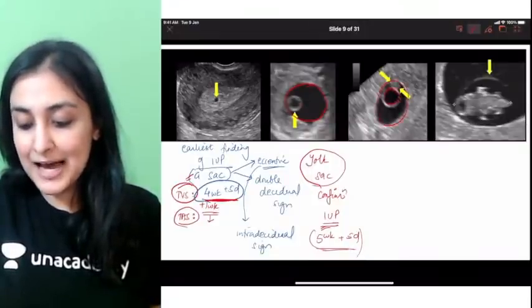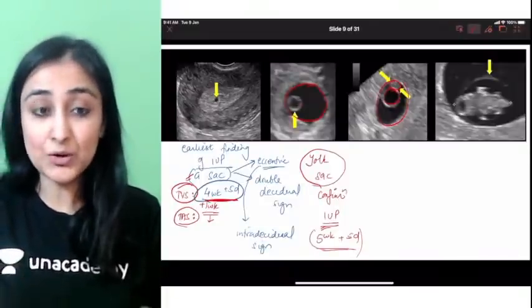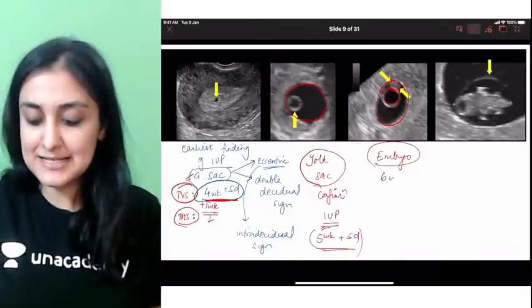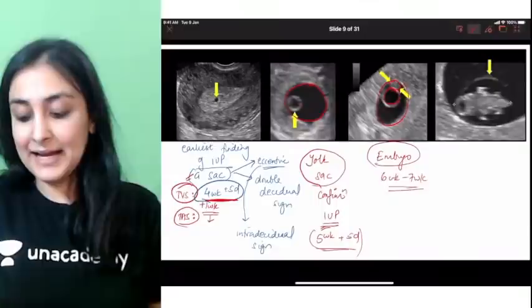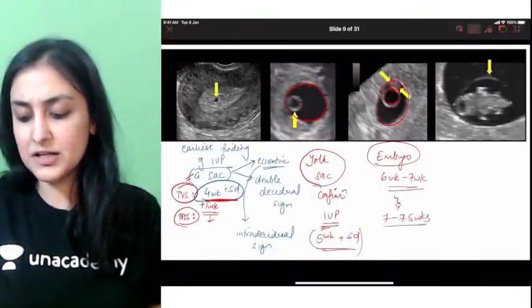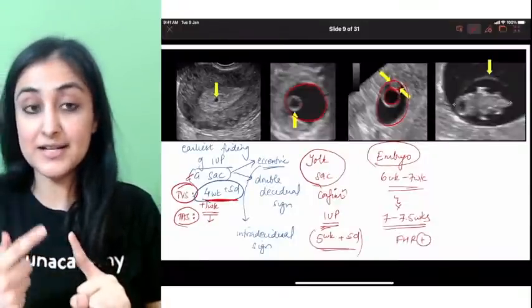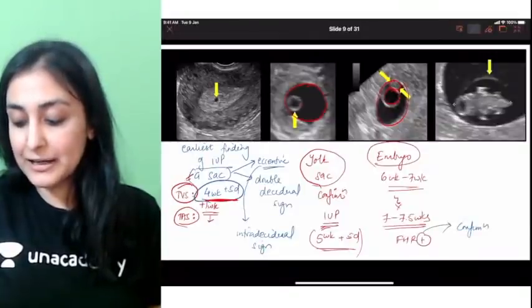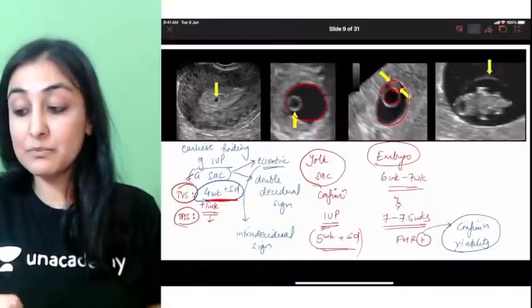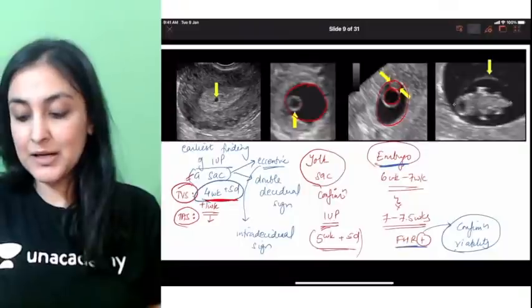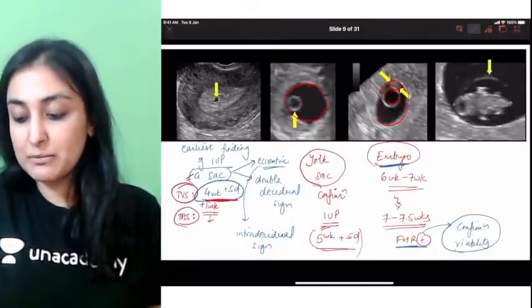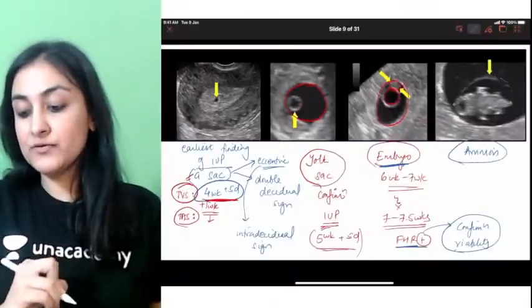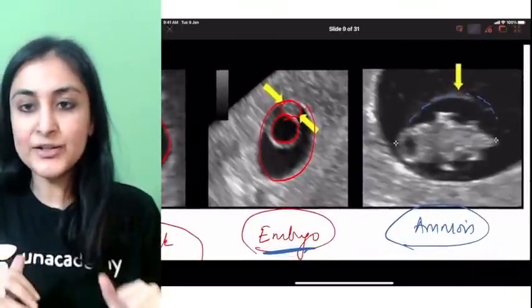At 6 to 7 weeks the embryo shows up. From 7 to 7.5 weeks a fetal heart rate starts to appear — this is confirmation of viability of pregnancy. So the sequence is: G-sac, then yolk sac, then embryo, then fetal heart rate. After that, the amnion also starts forming around the embryo.